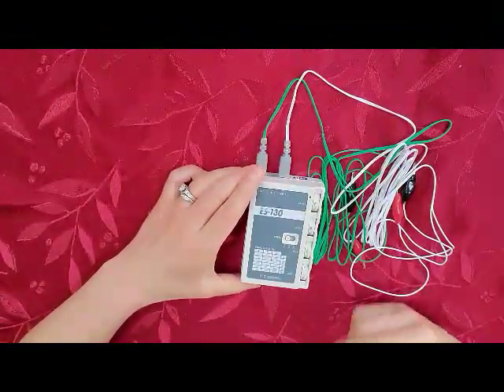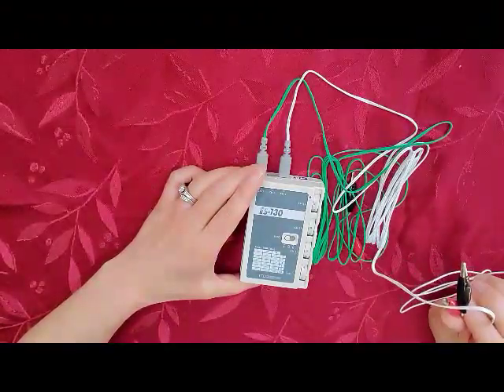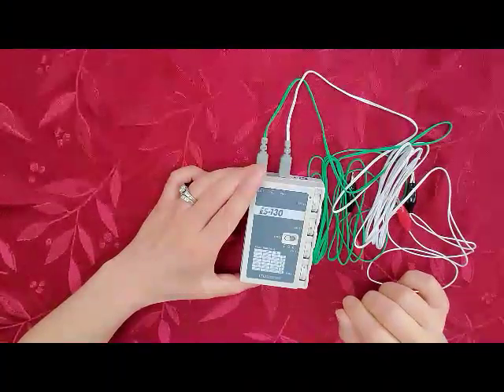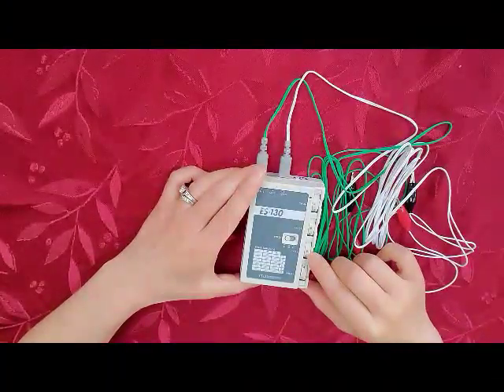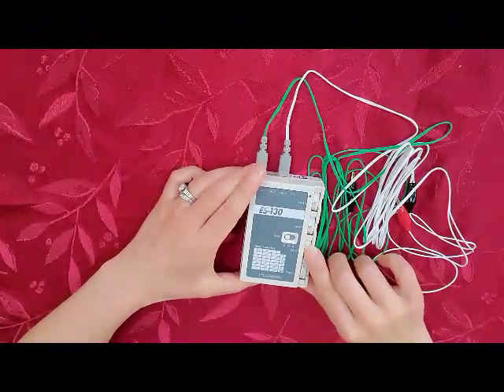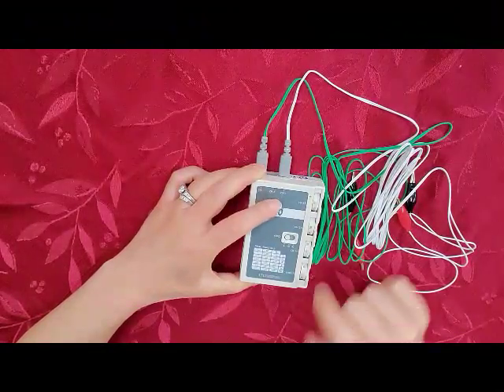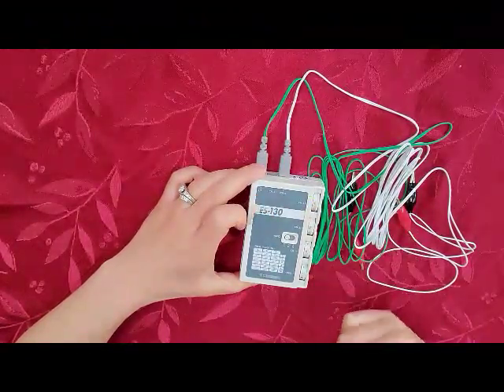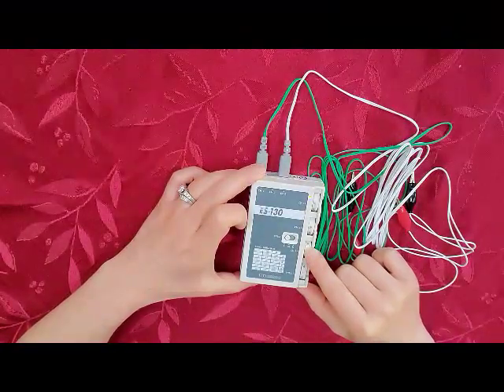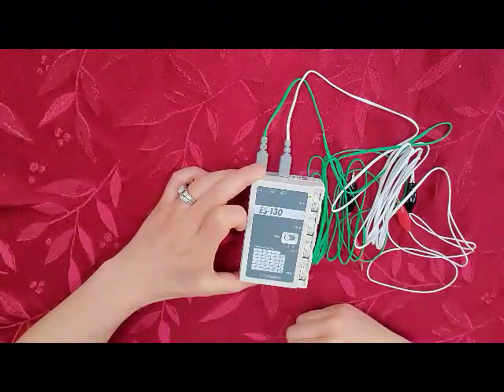So if we were going to utilize the unit, we would want to be sure that our electrodes are attached to the patient. And once those are properly attached, we would begin our treatment by turning on the appropriate channel. First, we want to just turn it just barely to the on position, and you'll see that the light starts to flash. And then to adjust our amplitude, we very, very slowly increase that amplitude to our desired setting.